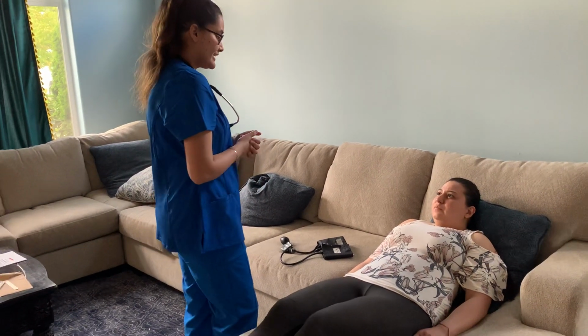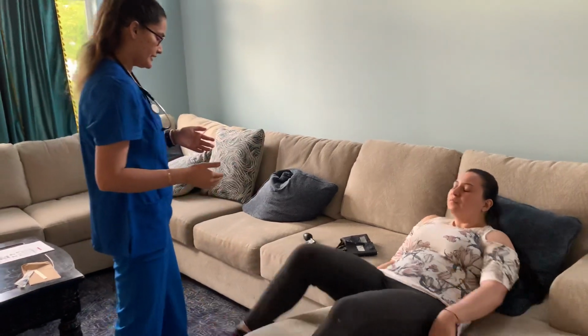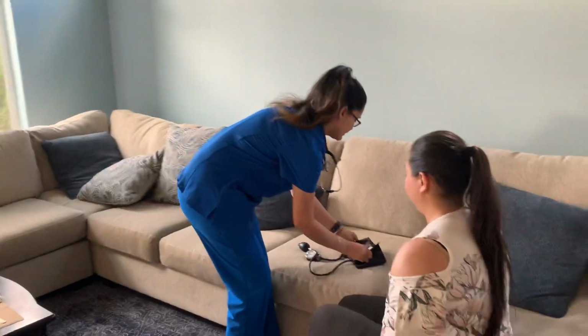Okay. So I'm going to start by taking your vital signs. So go ahead, sit up for me, please. I'm going to check your blood pressure.